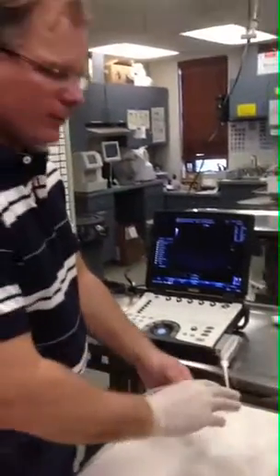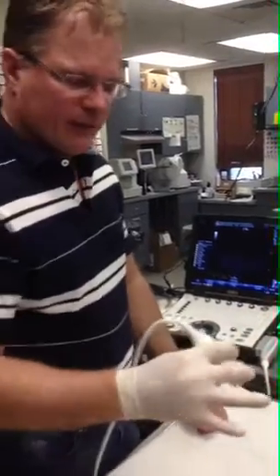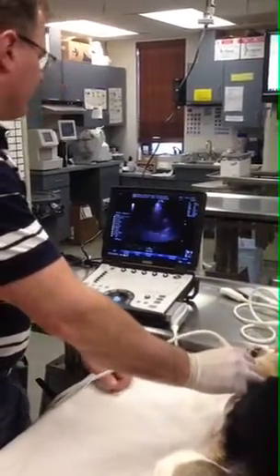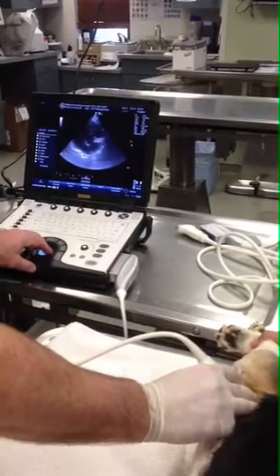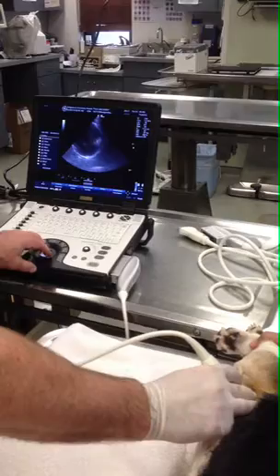The key is you want to look in that right auricle, which is where most of those tumors live. Just use my fingers here to collapse the lung and drop the probe right on top. And that's my right auricle right there — tricuspid valve, right atrium, and right auricle. This is where the tumors live most of the time. So if you have pericardial effusion here, this would all be pericardial effusion.